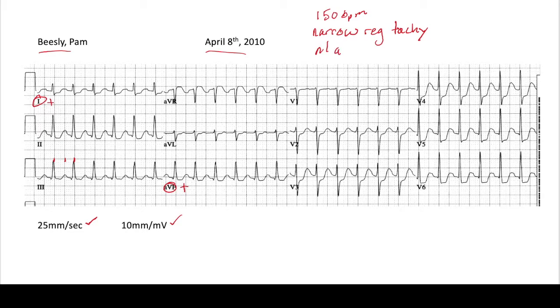For axis, we look at lead one and AVF. We see that lead one is positive, so your left thumb is up. AVF is positive, so your right thumb is up. So this is a normal axis. After rate, rhythm, axis, let's look at intervals. Looking at the P waves, it's hard to see where they are, likely due to the fact that this is a regular narrow complex tachycardia. So it's hard to assess the PR interval. The QRS is narrow. Looking at the QT, it looks like it's a little more than half of the R-to-R interval, but with fast heart rates we have to look at the QTc, because the QT interval is affected by how fast the heart is beating. So looking at the QTc generated by the EKG itself would be helpful.